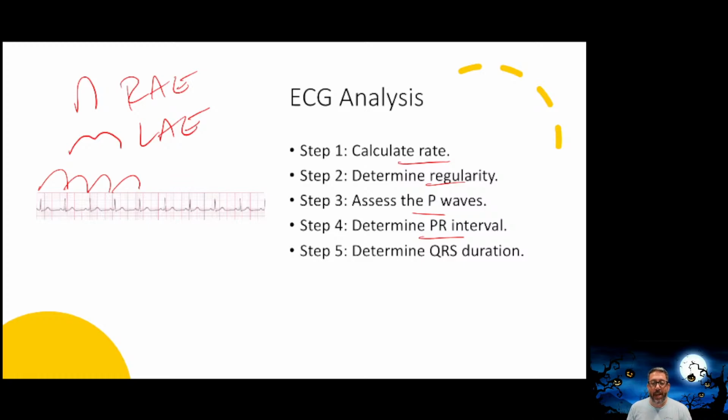You do not need to do anything about those fascicular heart blocks. Don't worry about the fascicular heart blocks or the posterior blocks. That's more for electrophysiology, tertiary care for these patients. Don't worry about those fascicular blocks. The bundles for sure. Right bundle, left bundle, make sure you know what those are. But the fascicular blocks, don't worry about. So PR interval, if it's lengthening, lengthen, lengthen, drop? There's your type 1. Are the PR intervals constant, but randomly you drop a QRS complex? Well, then you have your type 2.